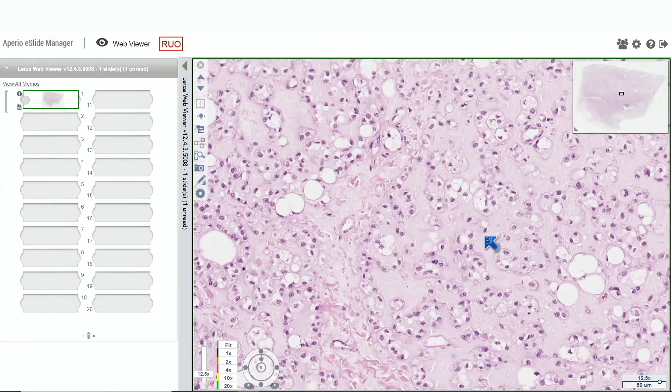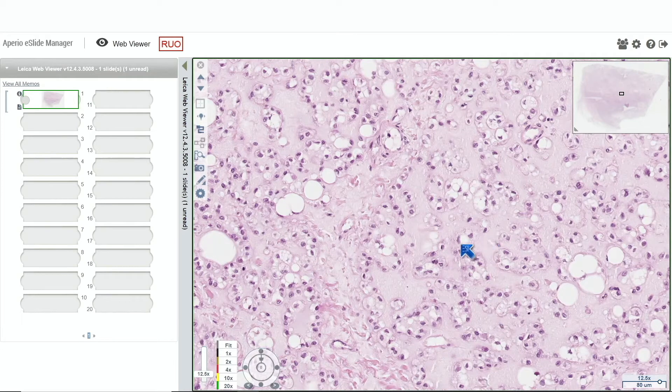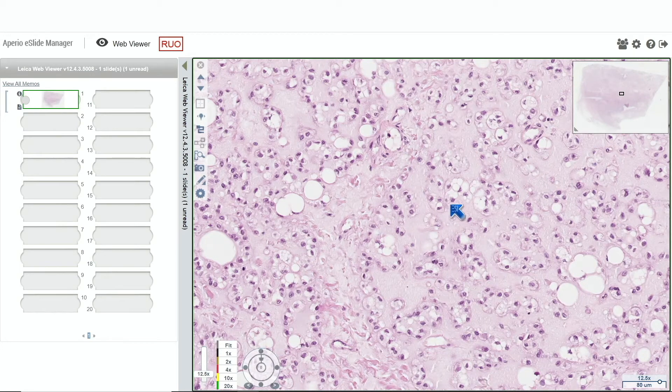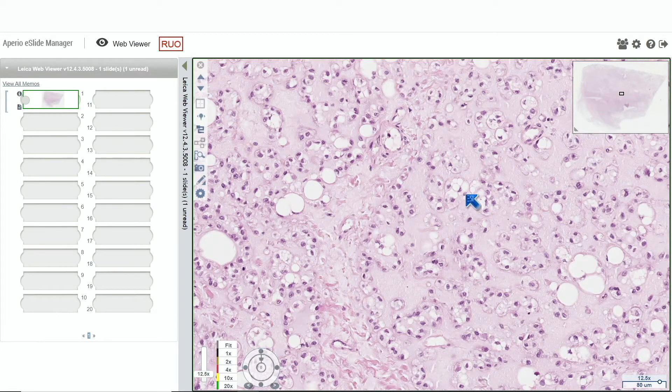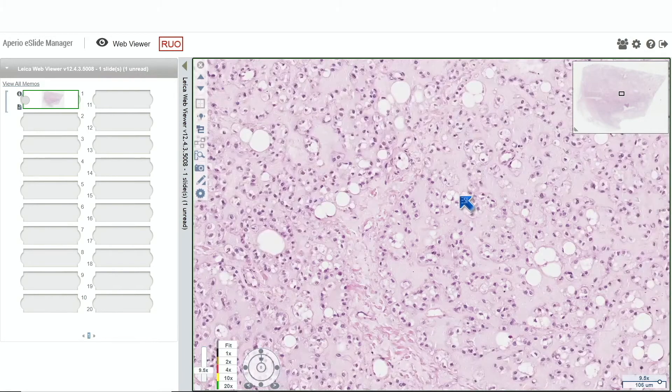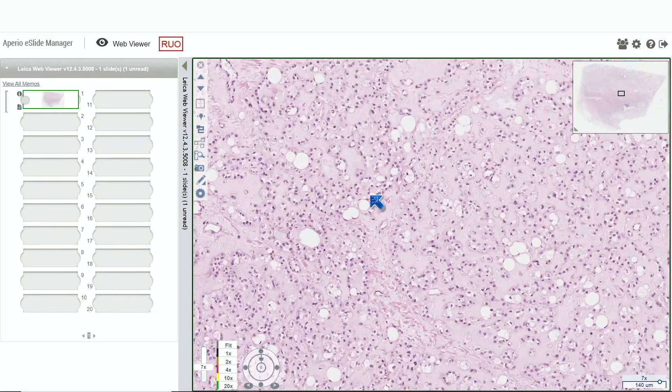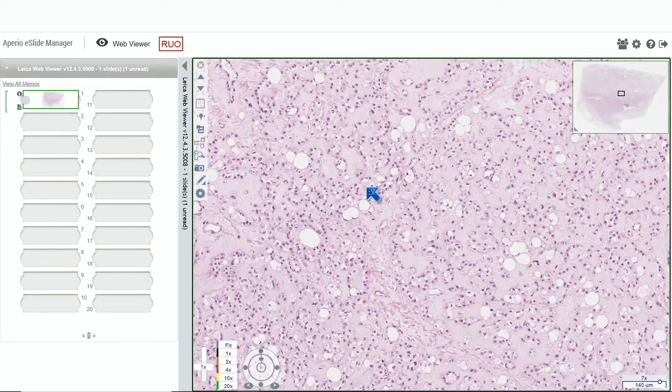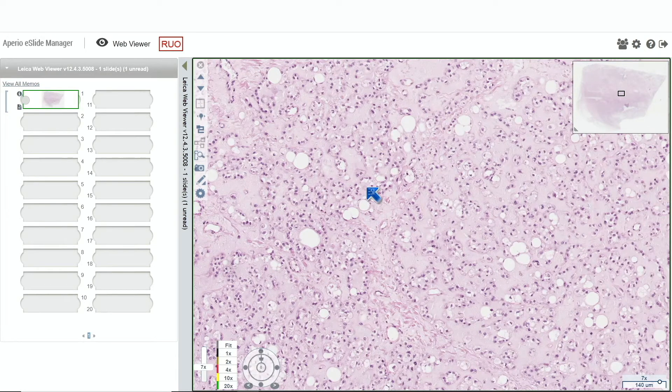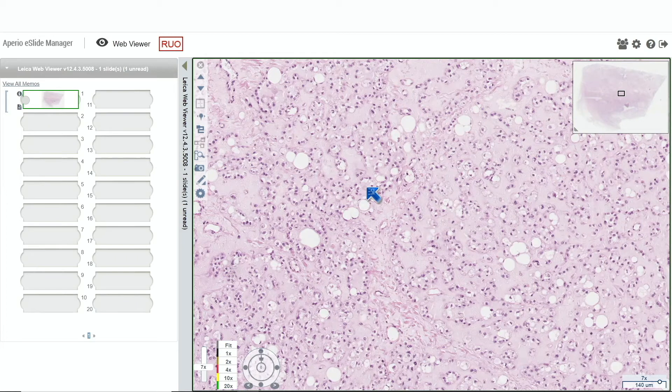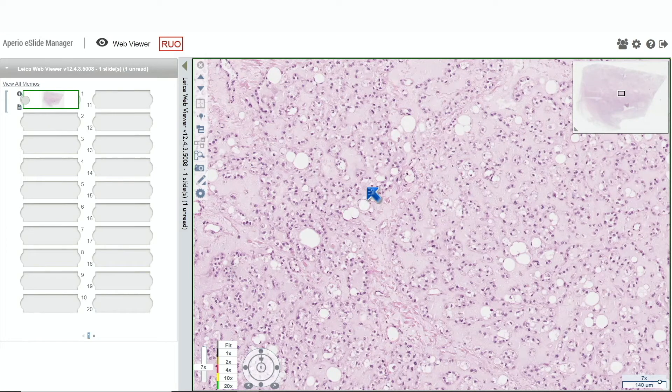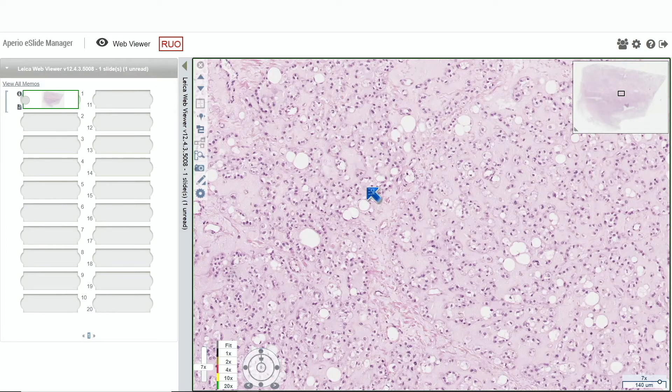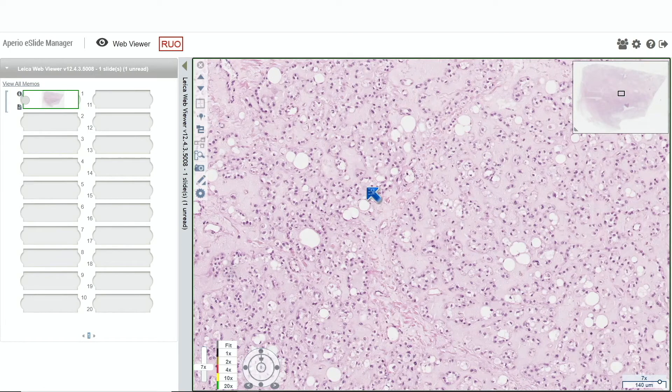Beautiful chondroid lipoma. This can be mistaken for lots of different things like chondrosarcoma or myxoid liposarcoma, but this is a chondroid lipoma. It's not a lipoma with metaplastic cartilage—that's different. This is a distinct lesion with its own cytogenetic characteristics. It's actually really rare.